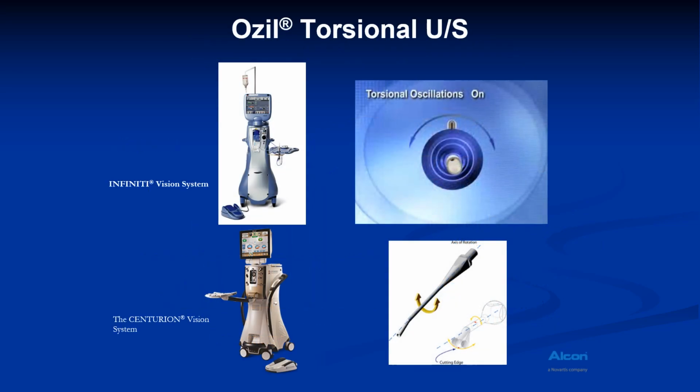Torsional ultrasound helps reduce burn by generating less heat. But cutting action is not as good as longitudinal ultrasound. So in a hard nucleus we can combine torsional and longitudinal ultrasound for more efficient emulsification.